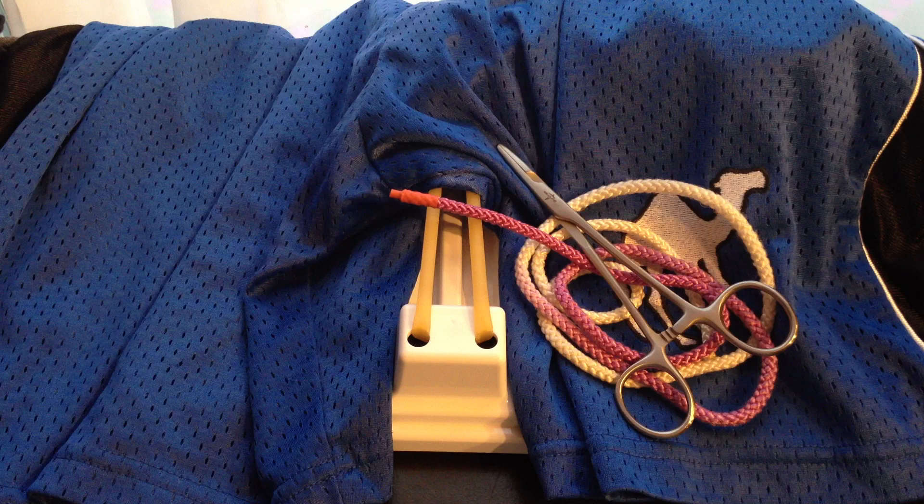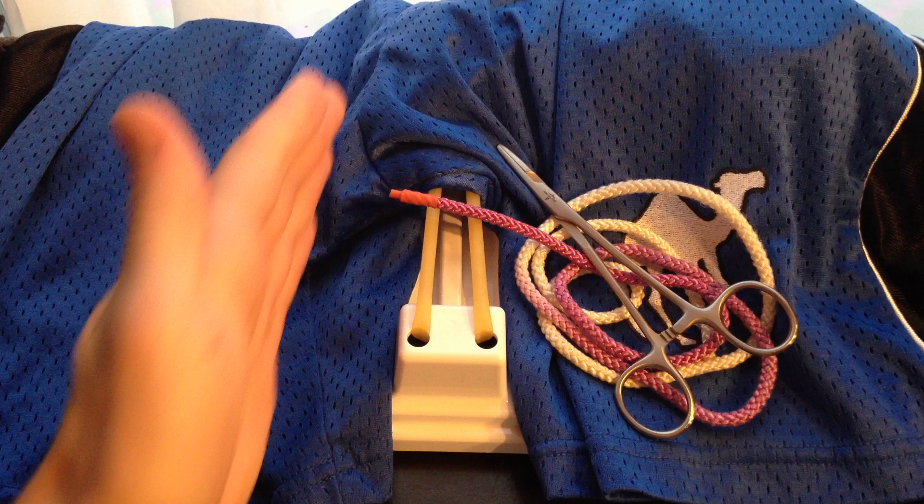Yo, Dr. Amadere here. Today I'm going to be teaching you how to tie the instrument tie, and this video is for right handers.